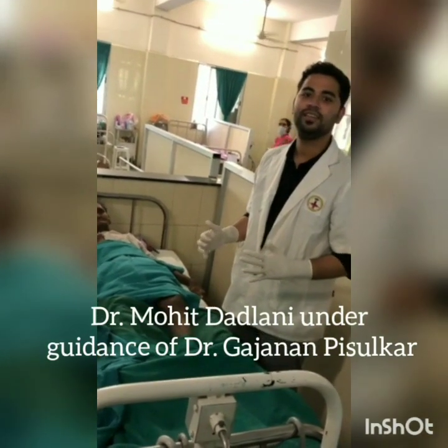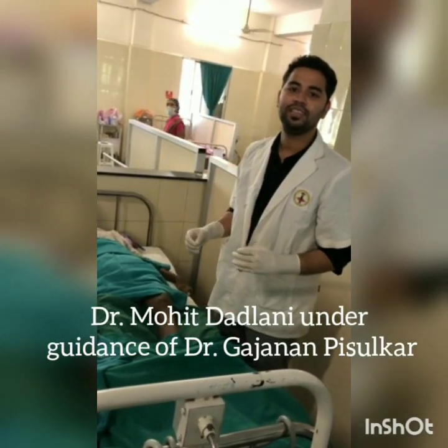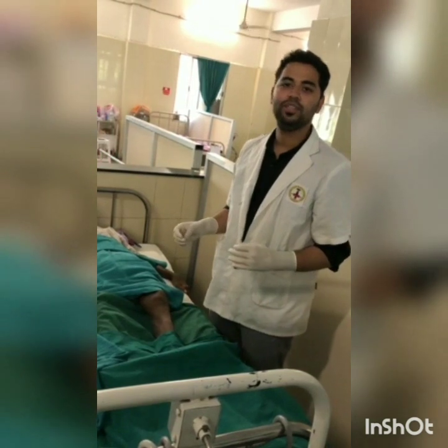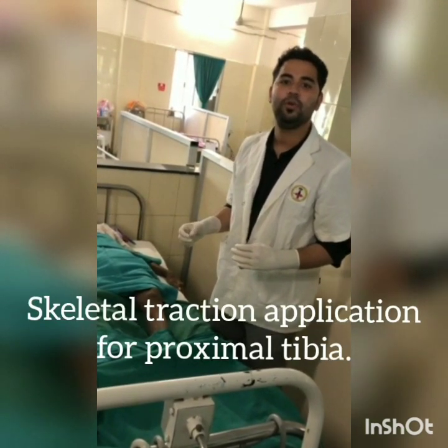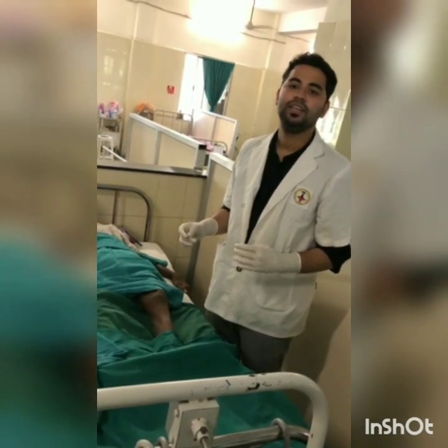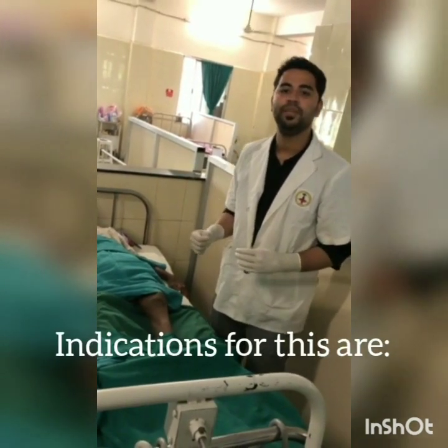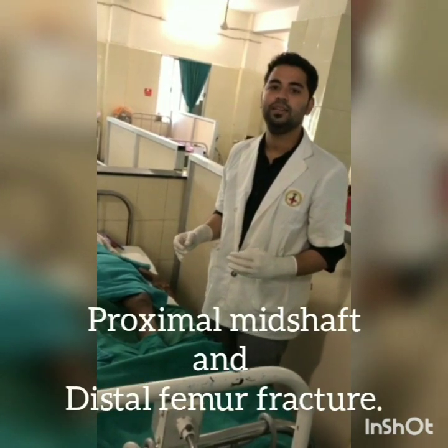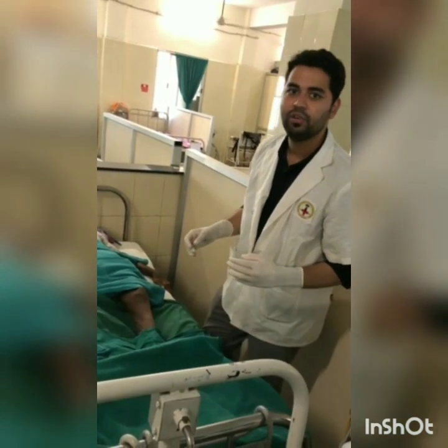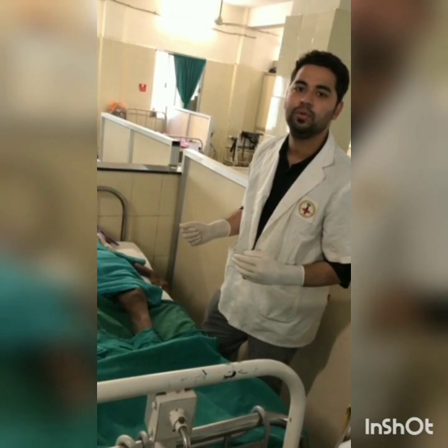I am Dr. Mohit Dadlani. Under the guidance of Dr. Gajanand Pisulkar, I am showing skeletal traction for proximal tibia. The indications for proximal tibial pin traction are proximal, mid-shaft, and distal femur fractures. Now I will demonstrate how to put a proximal tibial pin.